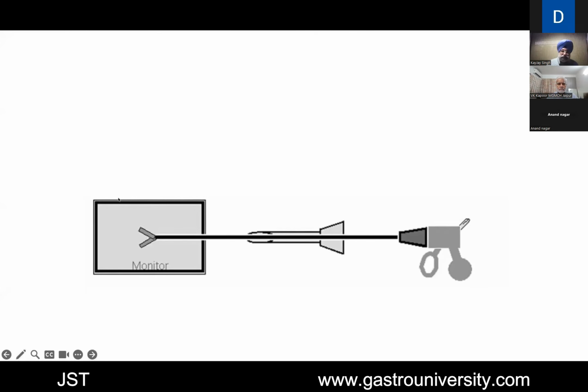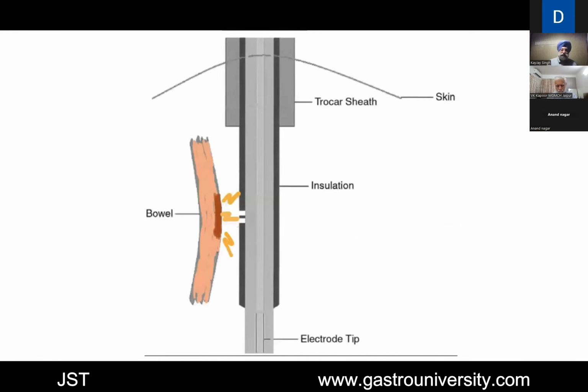Now you can see that the only part of the entire instrument visible to us is just about 25%. There are 4 parts, 1, 2, 3, and 4. I'll come to that in a while. Only about 1/4 of it is visible to us.